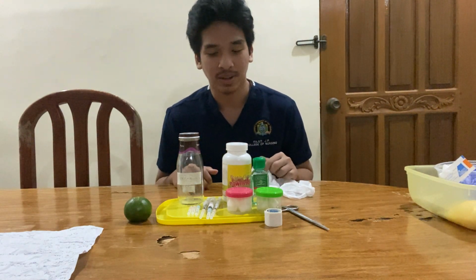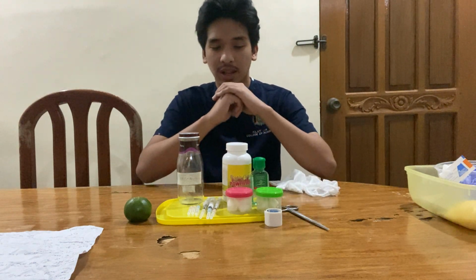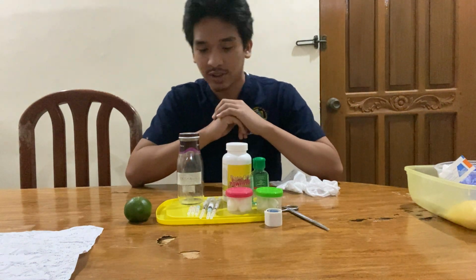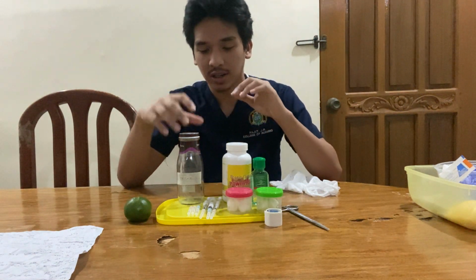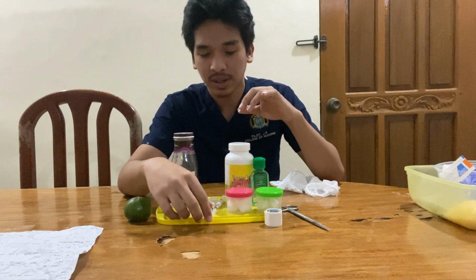Assuming now that I'm in the nurse's station, I will gather my equipment. So first, my equipment are 3 syringes, two tuberculin.